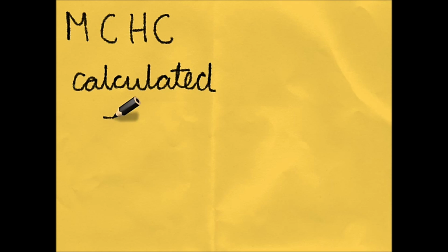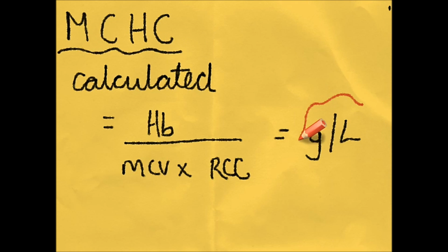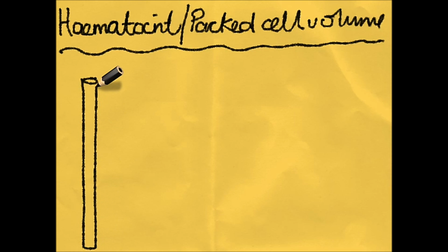The mean cell haemoglobin is an amount, and so is given as picograms or 10 to the minus 12 grams. The mean cell haemoglobin concentration is a calculated parameter derived by dividing the haemoglobin by the product of the mean cell volume and the red cell count. You can imagine if there have been any incorrect measurements in any of these parameters, then this will affect the accuracy of the MCHC. And certainly in Leicester, we've stopped reporting the MCHC. It's the least useful of all the parameters.